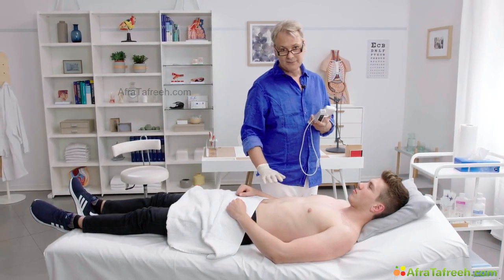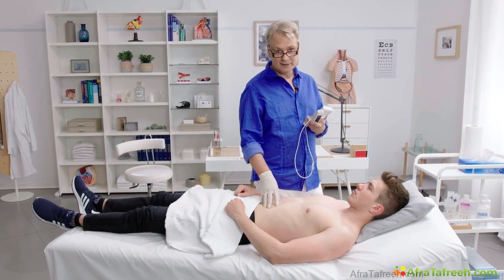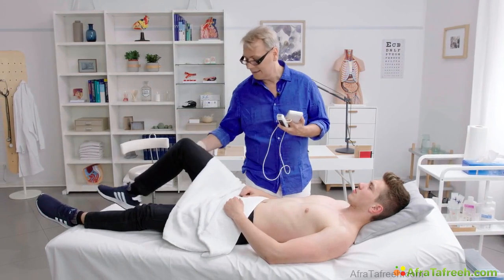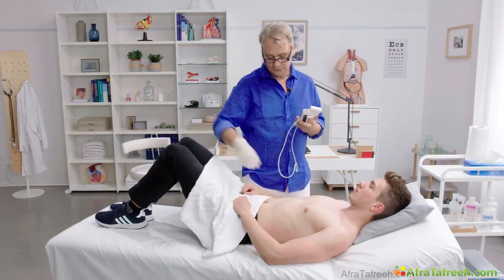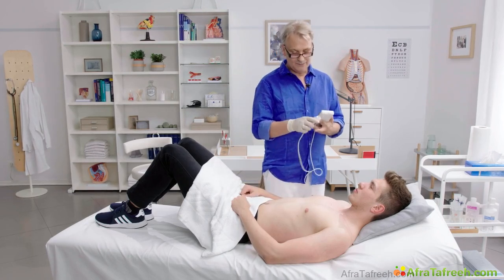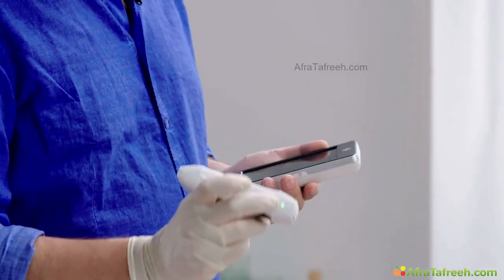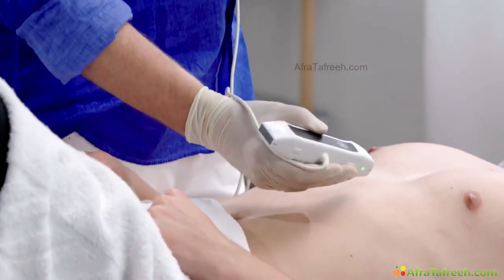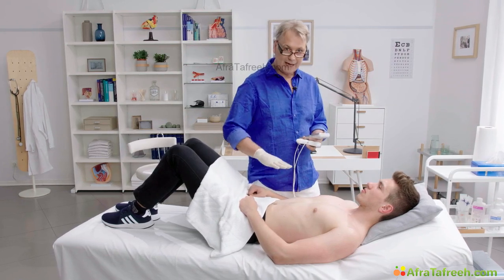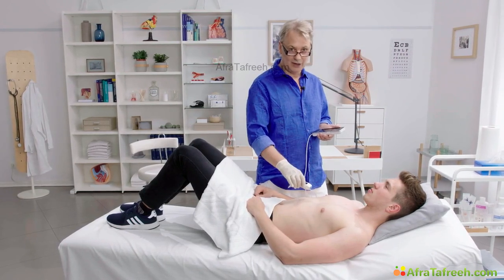A problem sometimes is that patients, especially if they're athletic, have very tense abdominal muscles. You can help yourself by letting the patient raise his legs a little bit like this. This will relieve the abdominal muscles and it will be easier for you to image. Again, we have to put the index finger here on the marker and put this marker towards the side, lateral. Since we want to image very shallow, it's advisable to hold the transducer actually like this from the top.